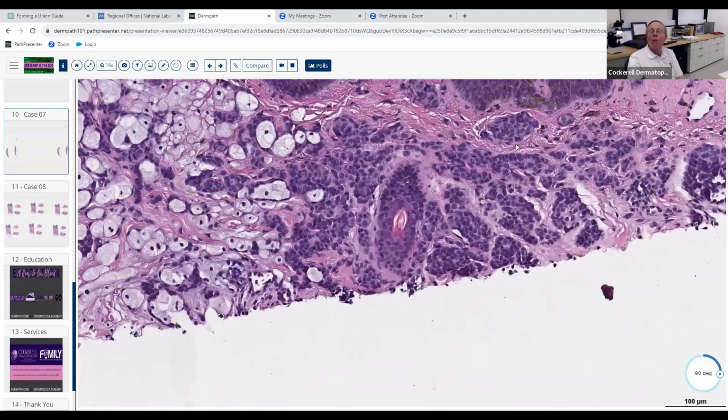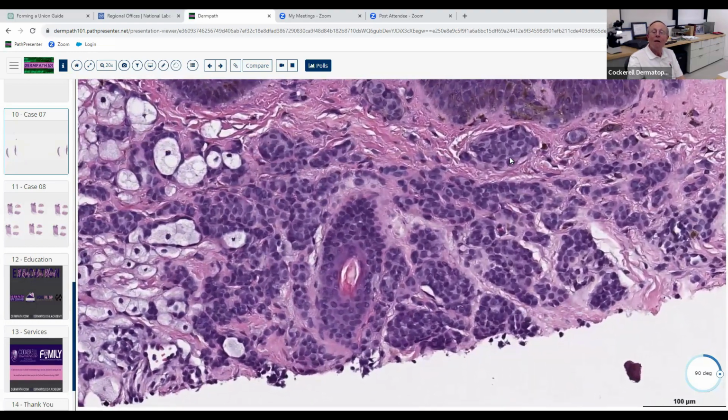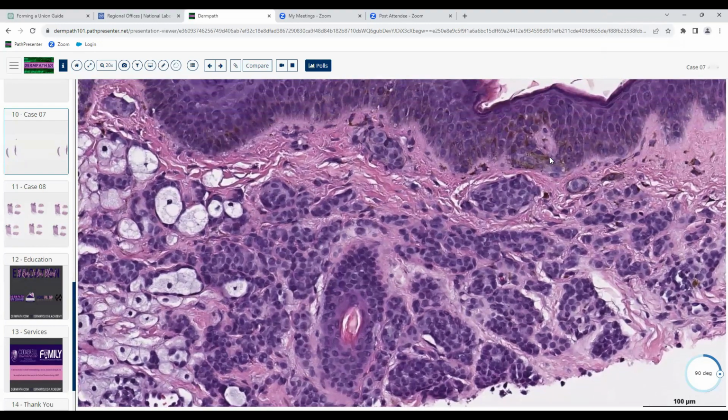Yeah. You know what kind of cells these are? They look similar to that blood vessel right there. Is that a blood vessel? No, I don't see blood vessels here. But maybe pigment up here. Oh, that does look like there's a pigment in there, like a hemosiderin or a melanin. Melanin. Yeah. Good. Melanin here too.